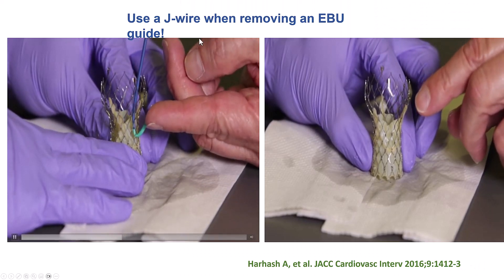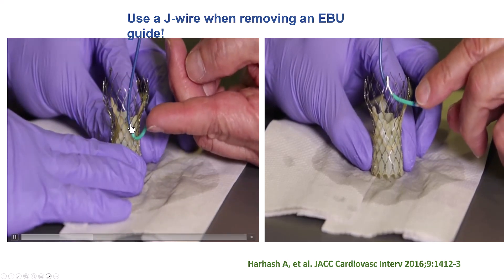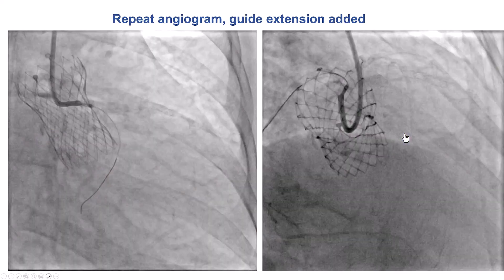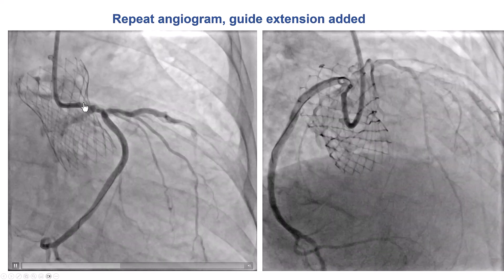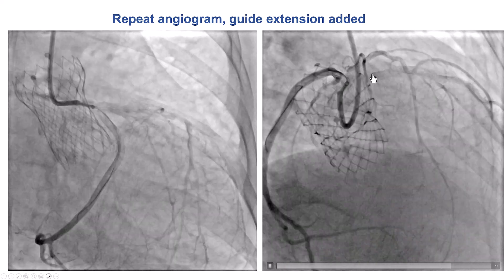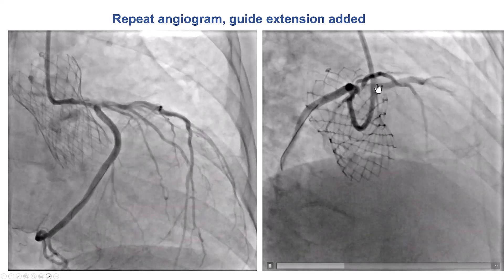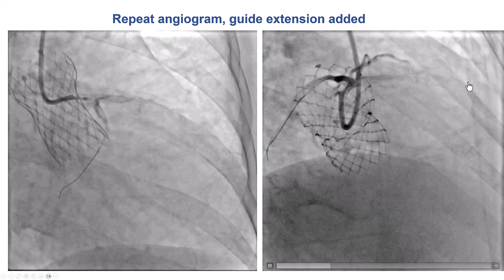When we use an EBU or XP guide, we have to be careful because if the guide gets kinked and we try to bring it back, there could be entrapment of the guide catheter. So it is important to actually straighten the tip of the EBU or XP before trying to remove it from a CoreValve. We got the wire into the circumflex, then used a guide catheter extension that went into the left main, and now we have diagnostic angiography. We can see that the ostium of the LAD has a very severe and heavily calcified lesion, which provides a better explanation for both the NSTEMI and the anterior wall ischemia.